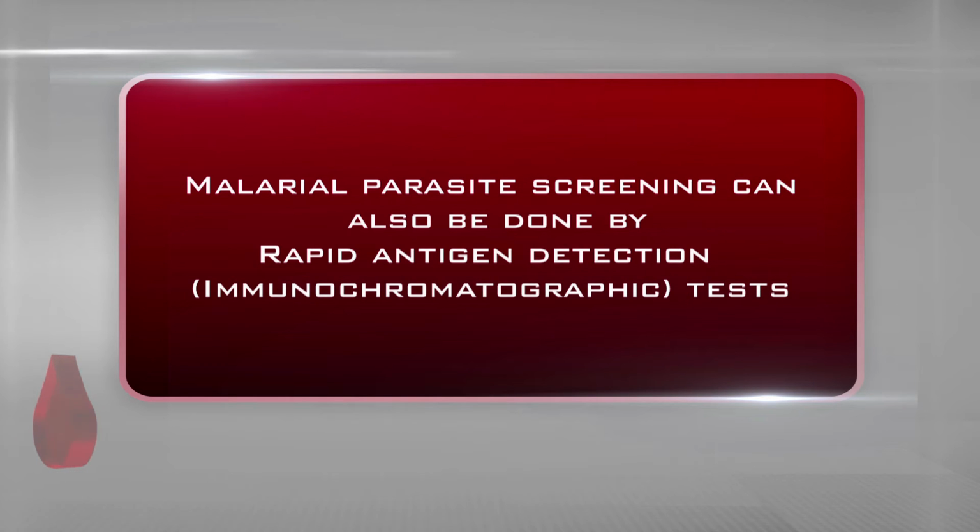Malarial parasite screening can also be done by rapid antigen detection, immunochromatography tests.